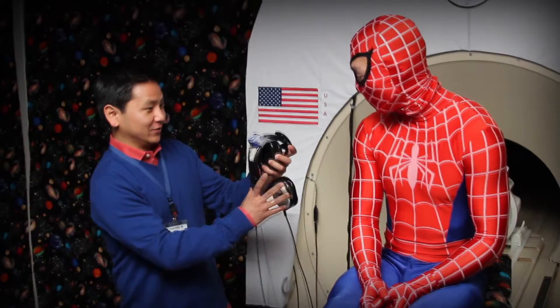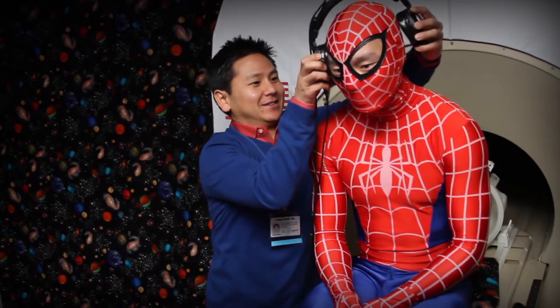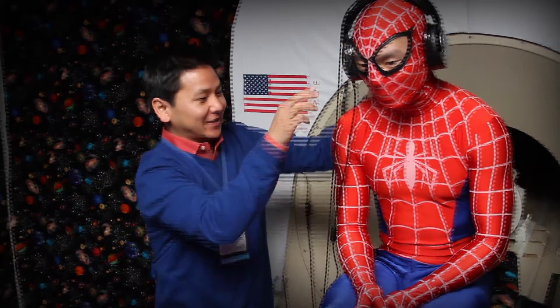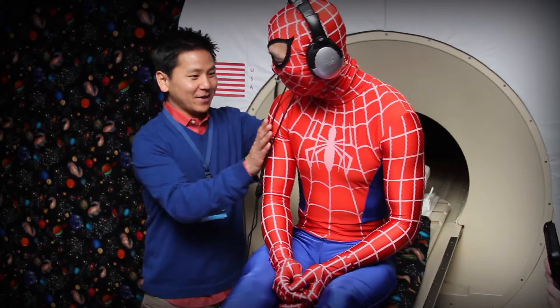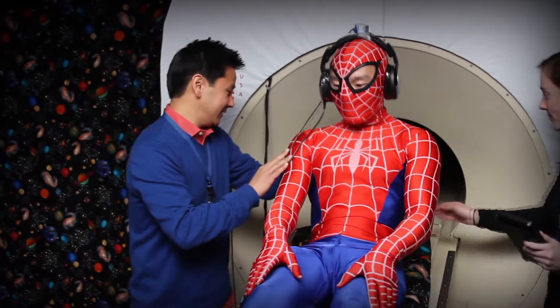Because the spaceship makes loud noises when it goes into space, we have a special pair of astronaut headphones for you to wear so it's not too loud. With your headphones on, you will lie down on the astronaut bed.